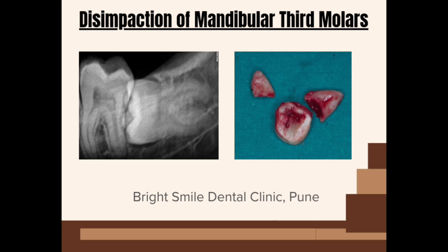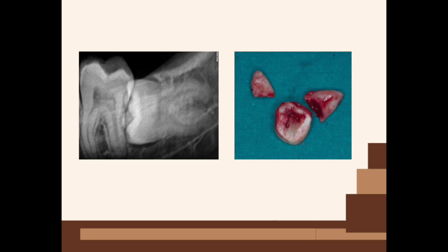In this case series, we'll take you through a case of mandibular horizontal impacted third molar and its management. We'll also share some basic info on third molar impaction, especially horizontally impacted mandibular third molars, and the surgical protocol for disimpaction of horizontally impacted third molars. We'll also witness some recent scientific data.